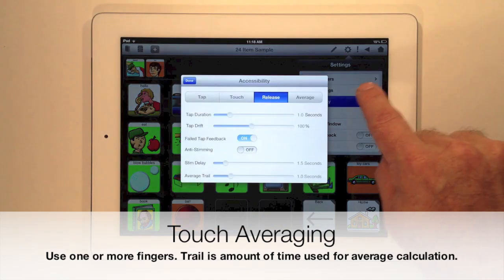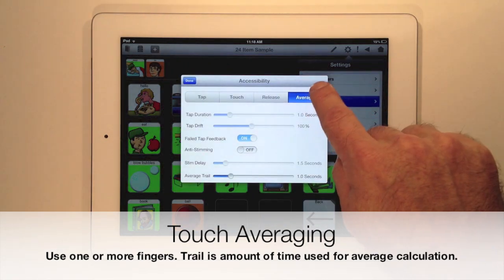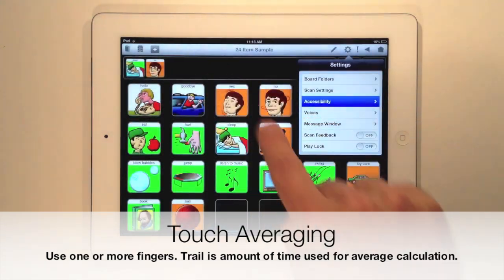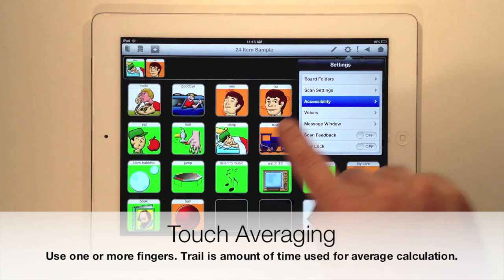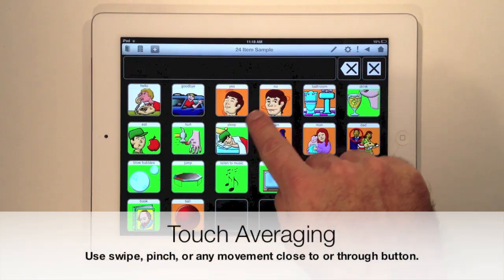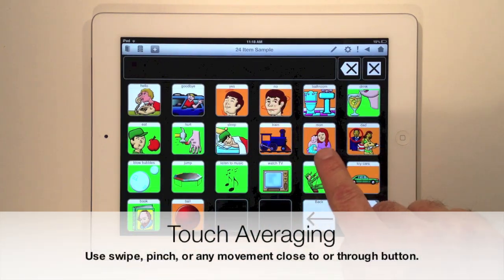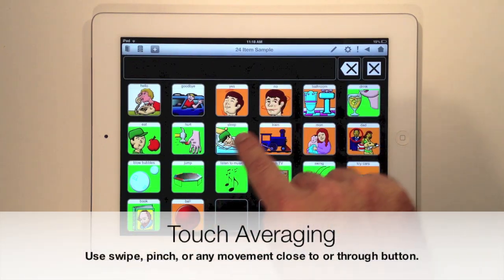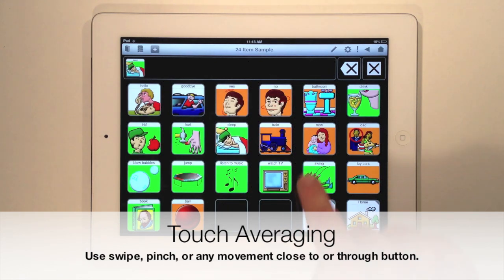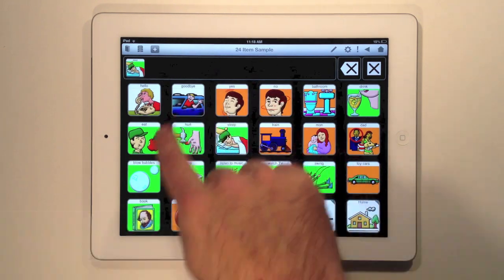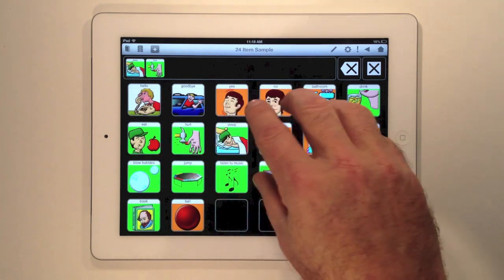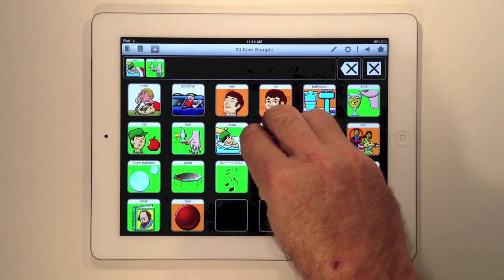Touch Averaging is similar to Touch and Release but lets you use one or more fingers to swipe around, close to, or use a pinching action to access a button. It's very flexible — try it out to see how it works best for you.